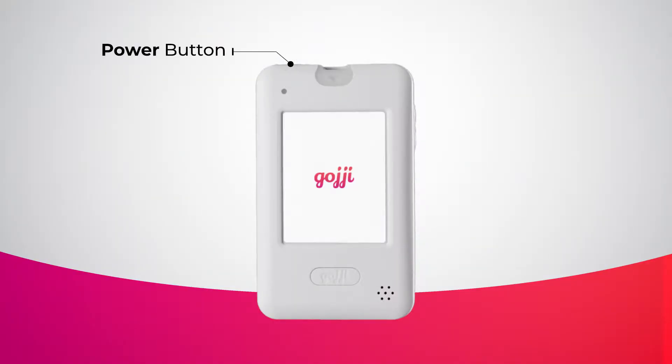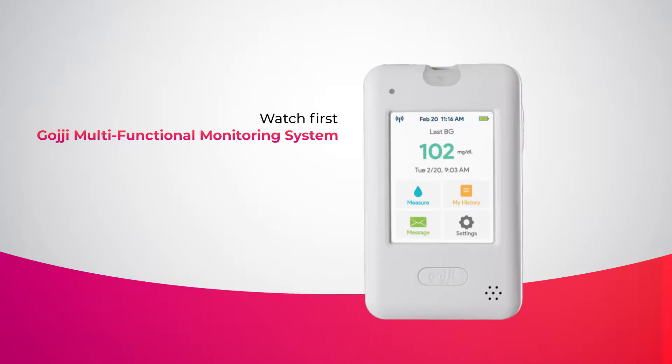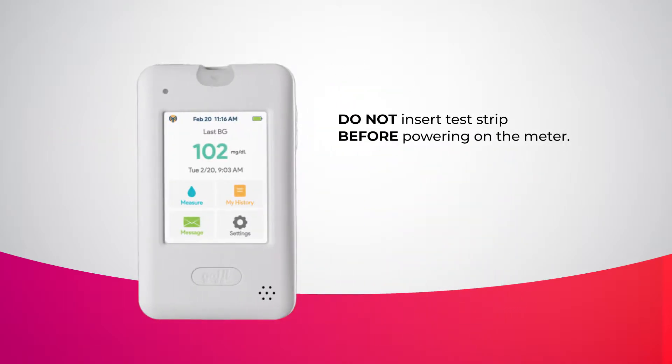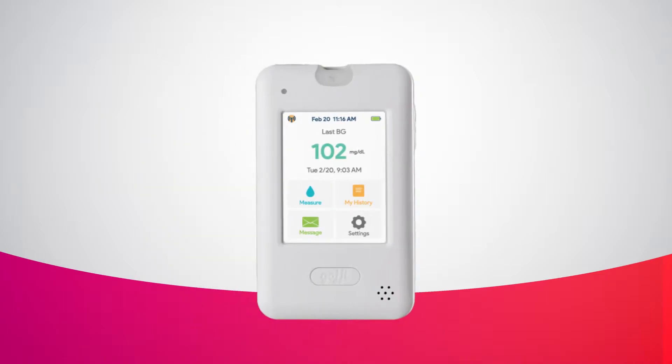Press the power button to turn the meter on. If this is your first time using the meter, please watch the GOJI Multifunctional Monitoring System video to learn more before beginning. It is important that you do not insert the blood glucose test strip before powering on the meter. Once you are ready, take one blood glucose test strip from the test strip bottle and insert it into the slot of the meter.